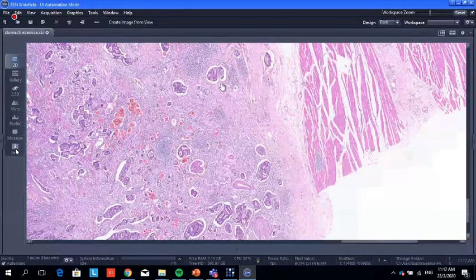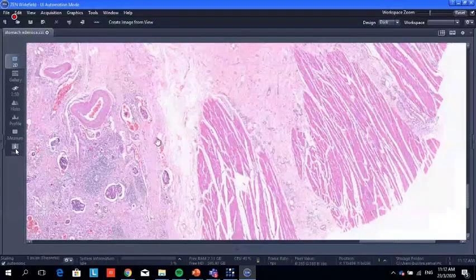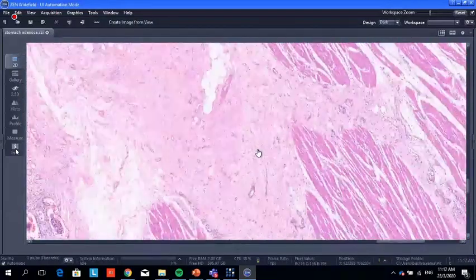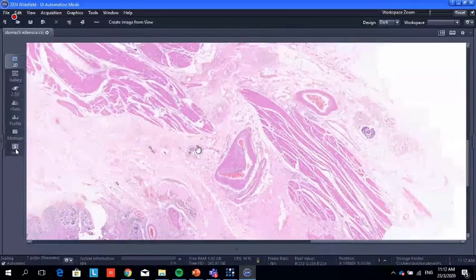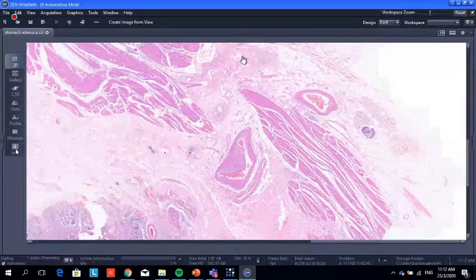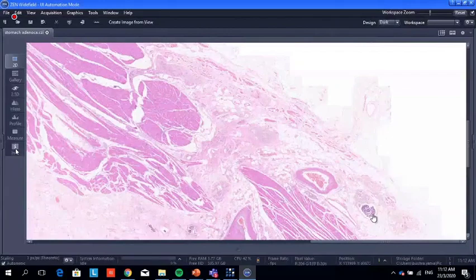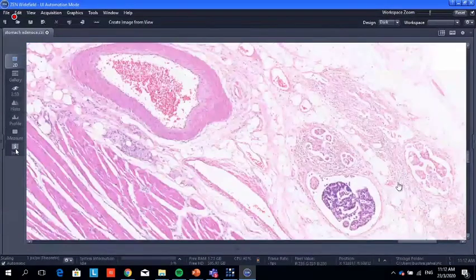See how the malignant cells invade the submucosa, and also reach the muscle layer, muscularis propria. It has already reached the serosa.